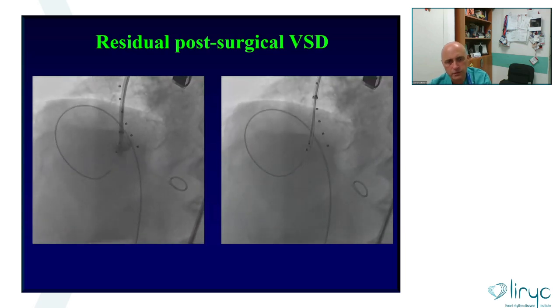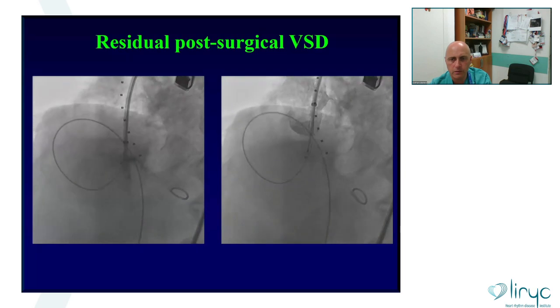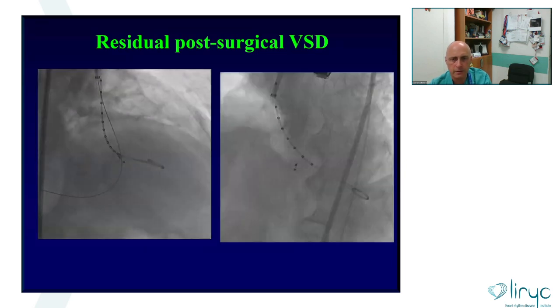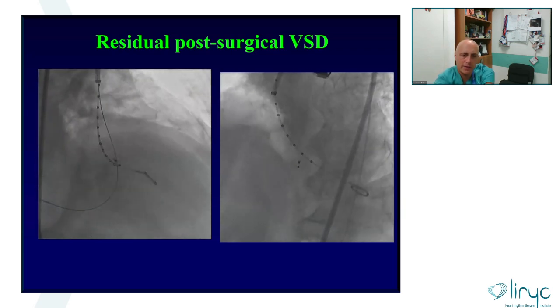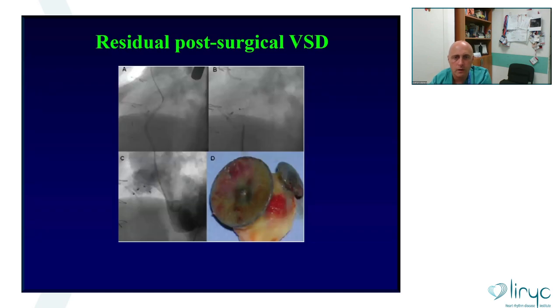And eventually, it is also possible to release the device from the delivery cable by having this safety net available. As you can see here, the device is over the wire. This is a Terumo wire, so very soft, and if the device moves or embolizes, it will probably be easier to retrieve. It happened to me just once, in a post-myocardial infarction VSD, and it was quite useful.